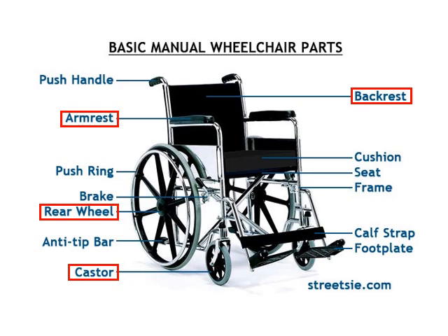the caster wheels. So for example, in a transport wheelchair, one that's an attendant propelled wheelchair, you may have 4 small wheels. But the rear wheels typically are larger and have a push rim or a push ring on them. The front wheels are called the caster wheels.